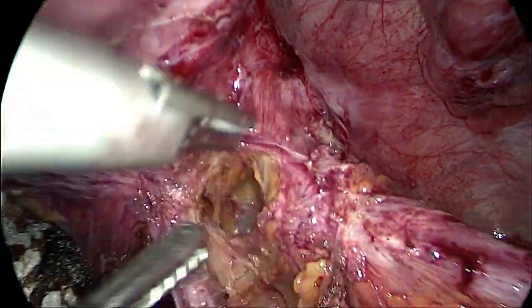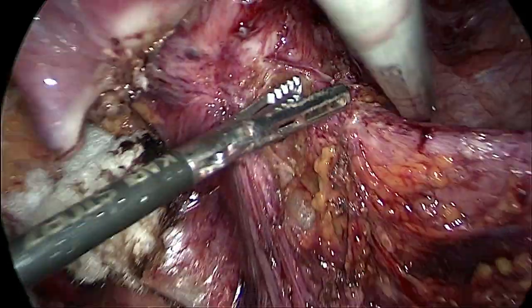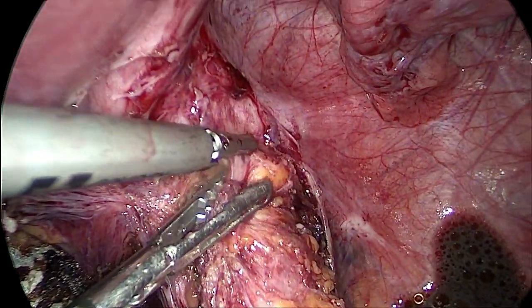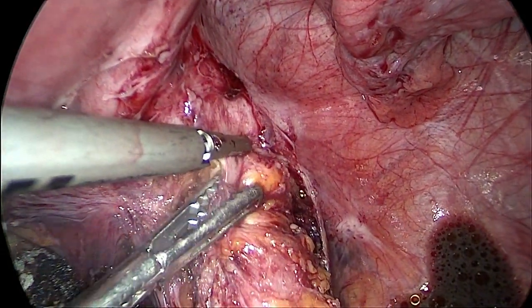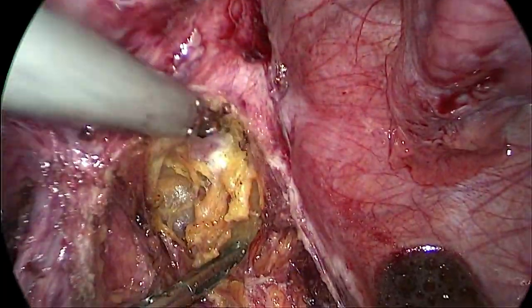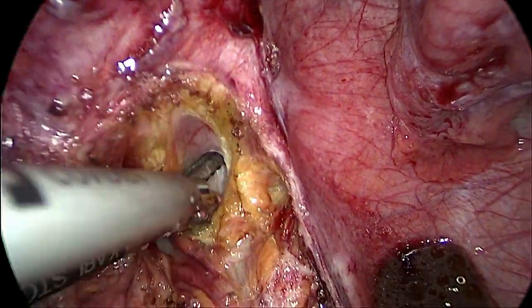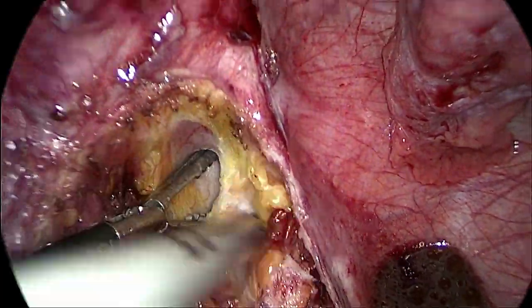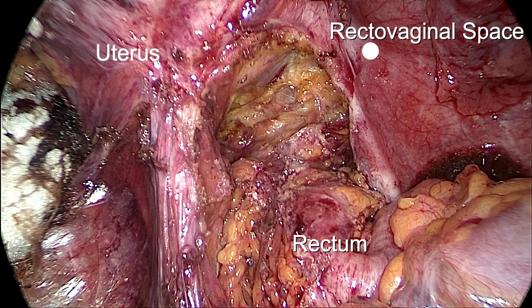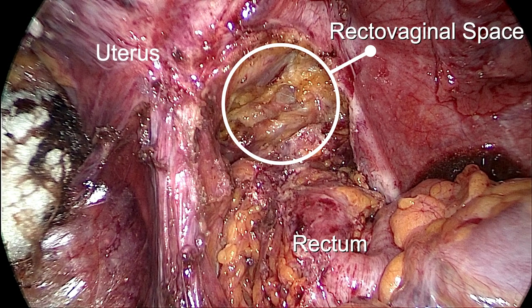The rectovaginal septum is dissected in order to separate the structures for resection. Visualization of the rectum, uterus, ligaments, and rectovaginal space is achieved.